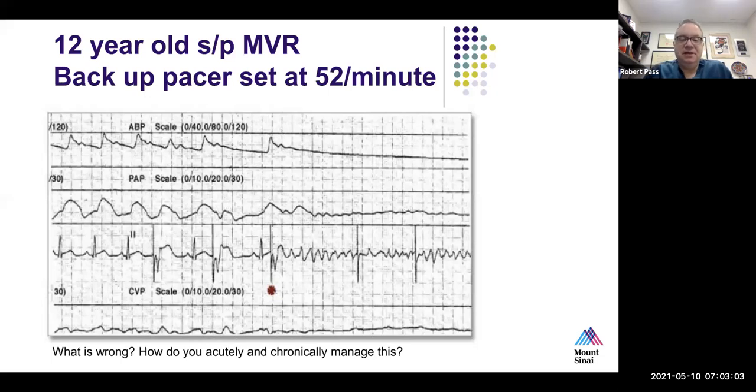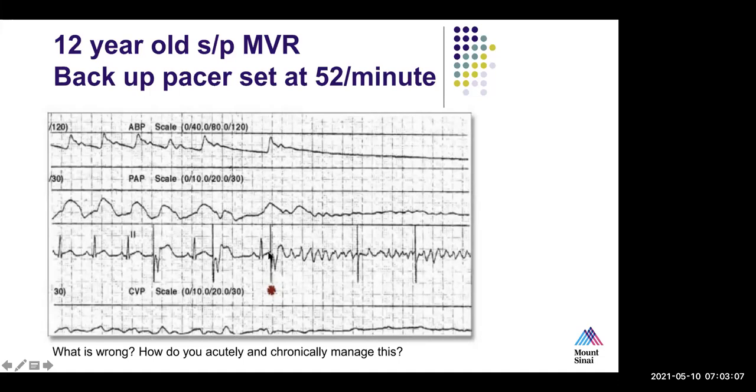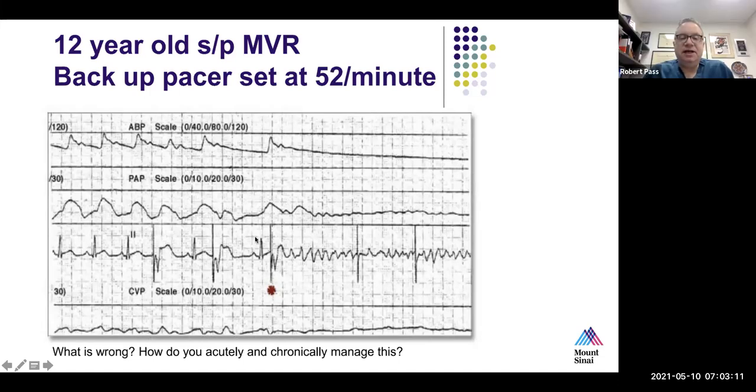That's right. You can see here that the pacemaker is pacing pretty much right on the time of the T wave. Also, as you astutely pointed out, this is clearly undersensing, because if the pacemaker is programmed at 52 beats per minute, certainly there should not be a paced complex at a rate of about 190 beats per minute after the last sinus beat, right? So this is a very extreme example of one of the potential risks of setting people in a backup mode through temporary wires. We often have this idea that when we program somebody back up, like say VVI, this is actually safer than not having the pacemaker programmed. But this is an example of undersensing and what can happen if you undersense, that you pace on top of a T wave and cause a very serious problem.